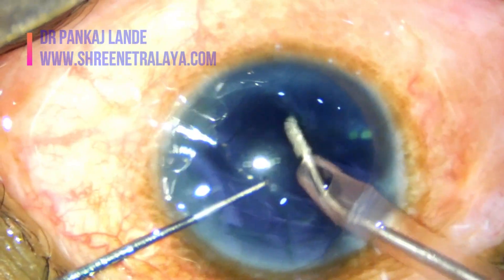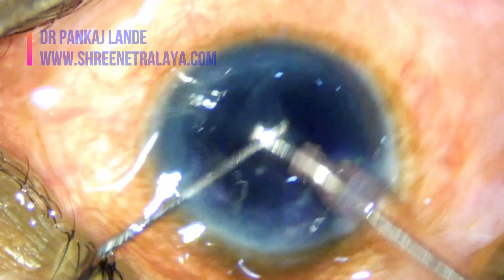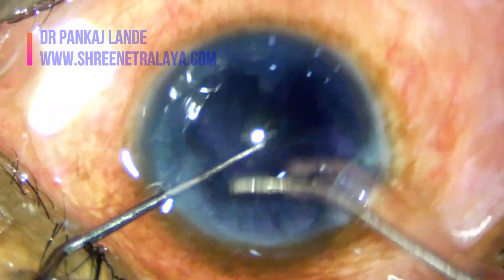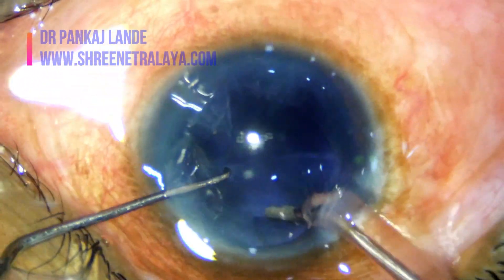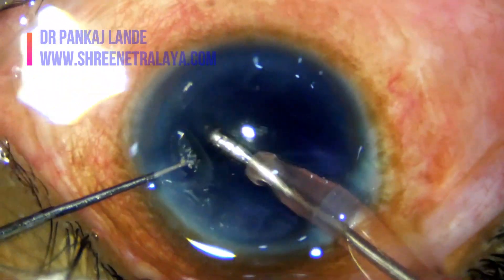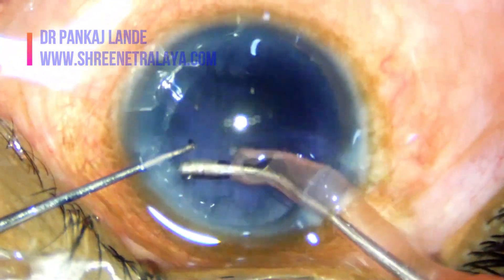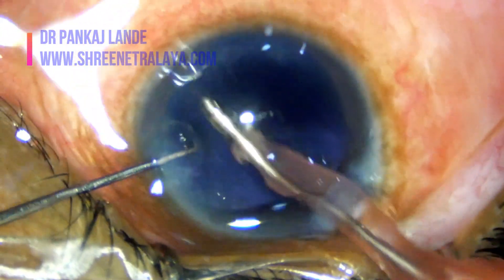In these cases the patient can have a complication at any stage of surgery, even while performing irrigation-aspiration, as these capsules are very thin. IOL implantation should be done under a good viscoelastic cover. You must keep a three-piece foldable IOL ready for these cases as you may need to implant the IOL in the sulcus.